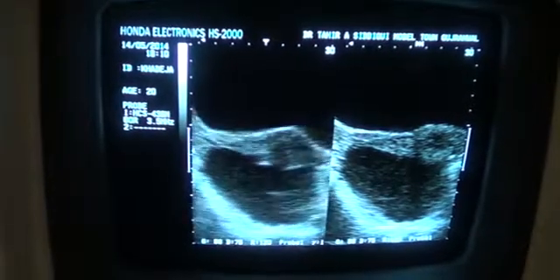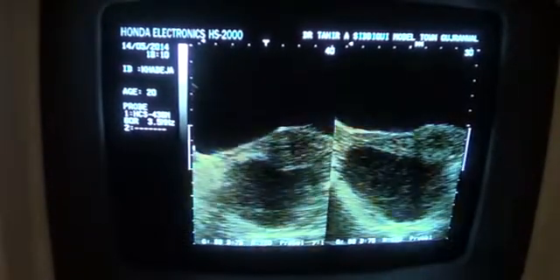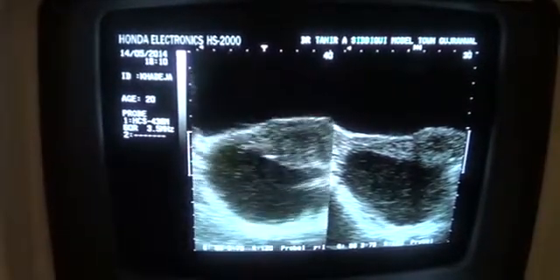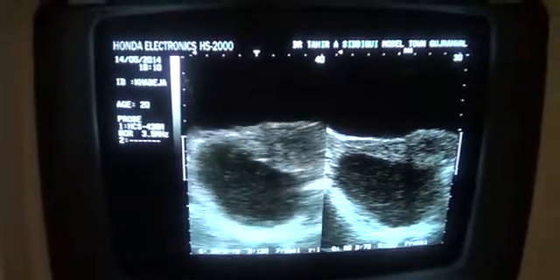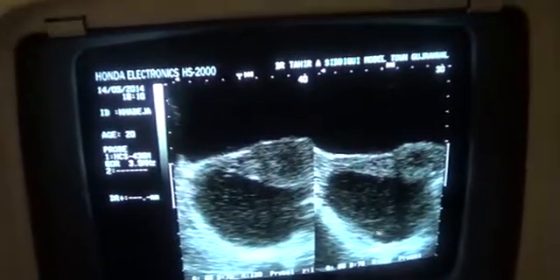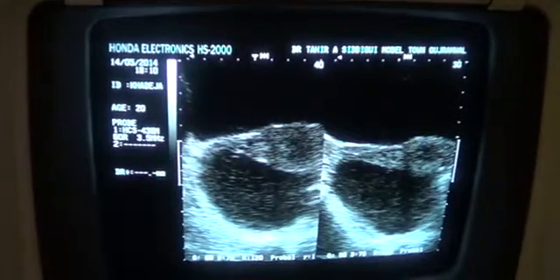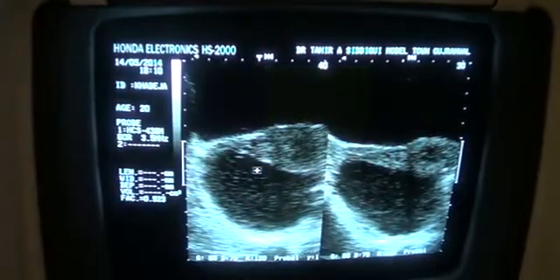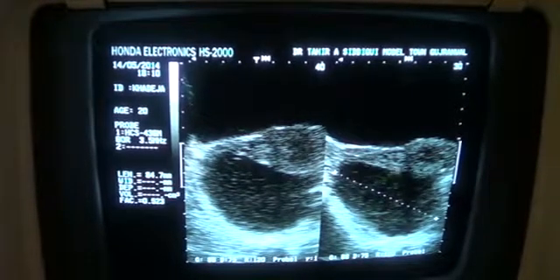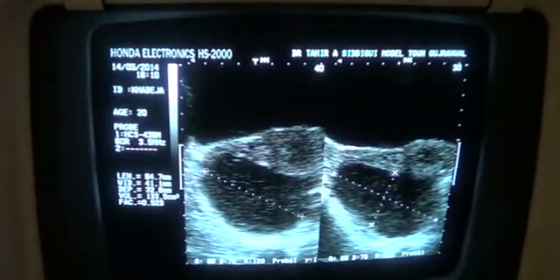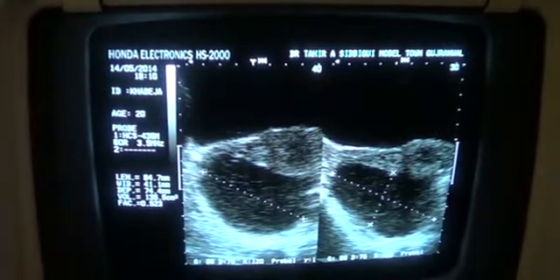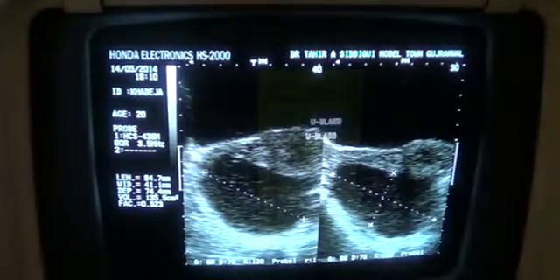This is the longitudinal section of the cyst and this is the transverse section of the same cyst with internal echoes. And why this is cystic — because you can see the strong-type wall on both sides. Now let's see what is the approximate calculated volume of this echo-filled ovarian cyst. It is 135 ml — that is the calculated approximate volume.